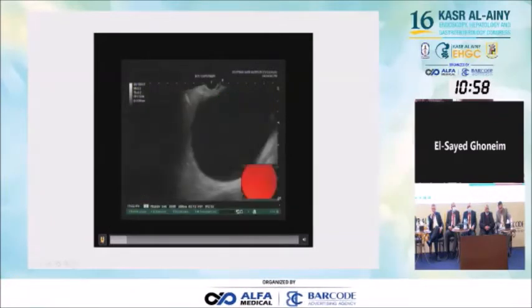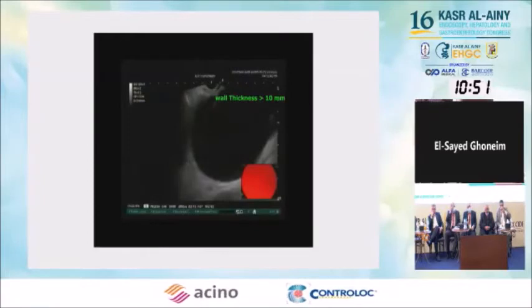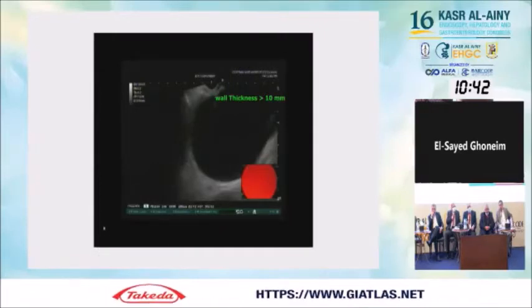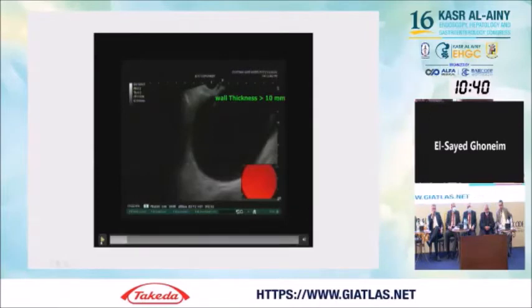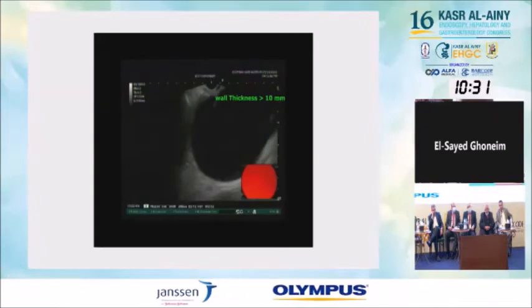So we decided to search for another thinner distance. We found it through the duodenum, so we decided to do the procedure transduodenal. We shorten the scope like in ERCP to make the use of the accessory easy, and it changes the accessory rapidly and easily.